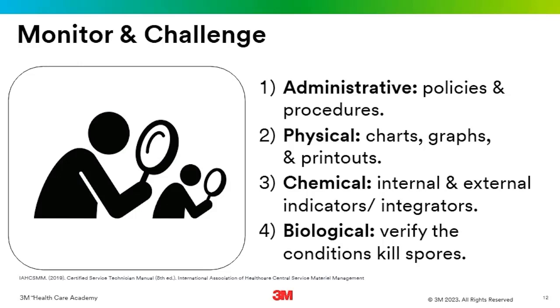Okay, so a lot of the times we forget about the administrative monitoring. And those are our policies and our procedures in our healthcare facilities. So all the policies that we have, the different ways we define wet loads, the ways that we list, hey, you have to take the autoclave out right when it rings. All of these are outlined in our department policies, and sometimes even our healthcare system policies. So let's not forget about the administrative work that comes in from these dynamic groups, your infection prevention group also. Another reason why sterile processing professionals should have a seat in this multidisciplinary committee.